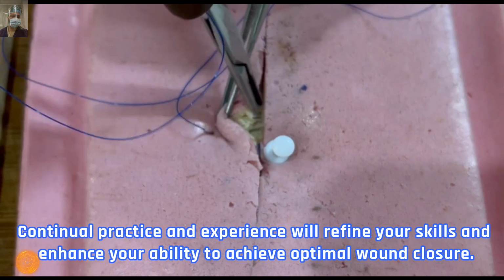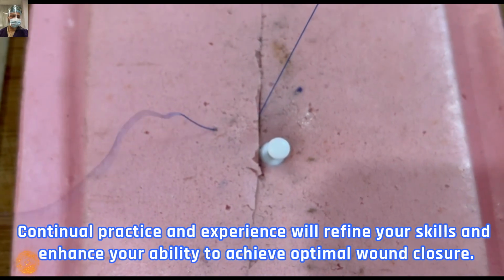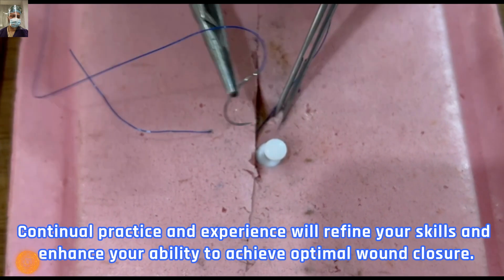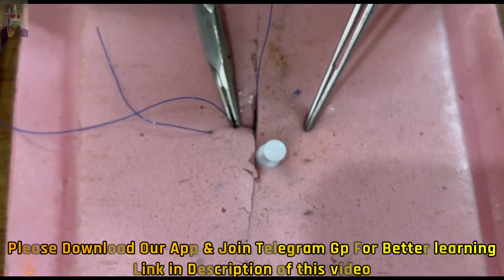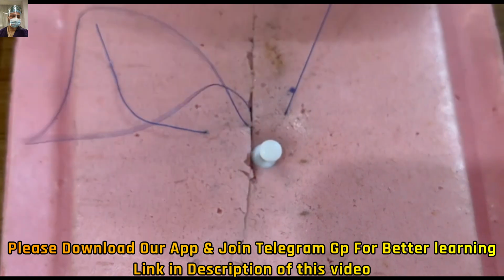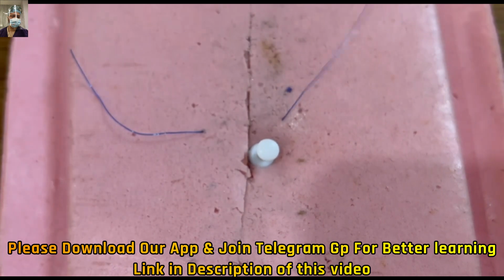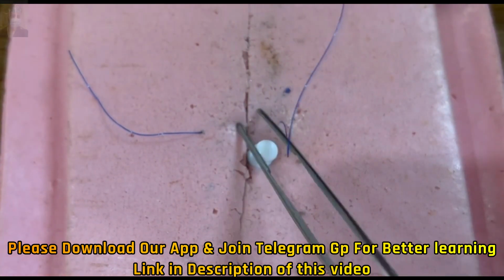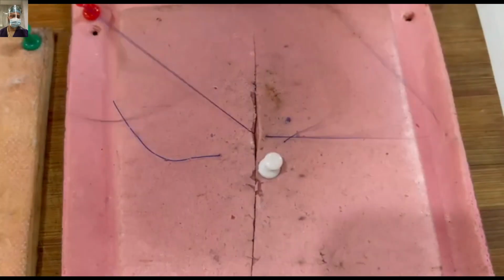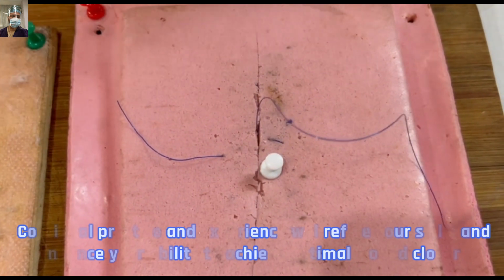Simply, we start in a similar manner, taking this simple interrupted suture, the far suturing. On the edge which is lower down, or where there is a tissue loss, we take a larger bite, more chunk of tissue, more depth and more tissue. Similarly, when coming back, while taking the near suture, I'll be taking more tissue on the side which is down, and lesser tissue on the side which is higher.